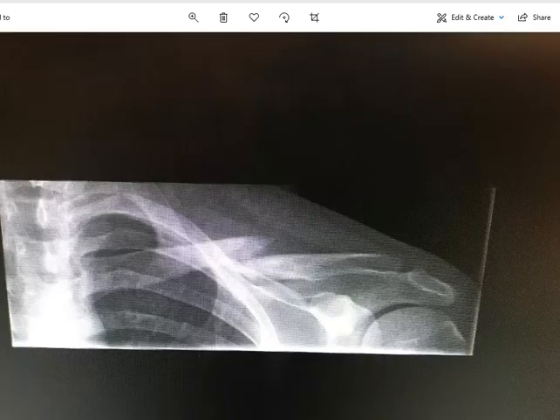Here are two different images of the clavicle. One is the AP and one is AP axial. Even though you don't see a whole lot of difference between the two, you can see a little bit of information on one that you just would have missed had the axial not been performed. We can tell that this is the AP based on how low the clavicle is. So we've got the first rib, second rib, third rib, fourth rib, just like on a chest x-ray. Clavicle's at the fourth rib. So we can see an obvious fracture, and they tend to fracture pretty sharply.